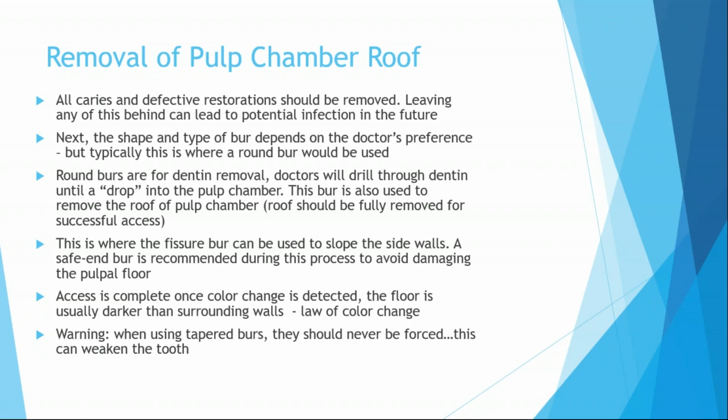And then the doctor can determine the access is complete once the color change is detected. So the surrounding walls will be much lighter than that pulpal floor. And then I just included here as a warning, when doctors are using tapered burrs, they should never be forced. I mean, really with any of the burrs, they shouldn't be forced because then that will actually weaken the tooth.